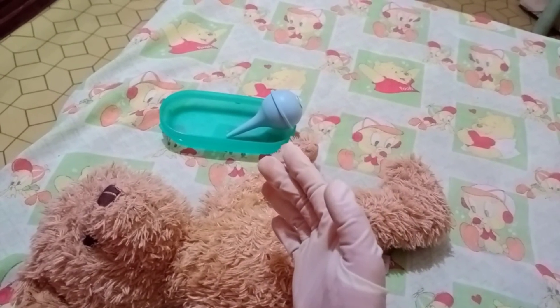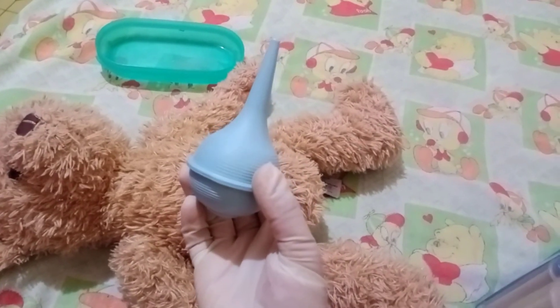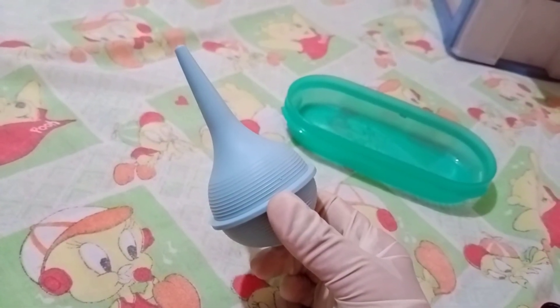Discard the collected secretions properly and clean the receptacles. Wash the bulb syringe in warm soapy water, rinse and dry. Place the bulb syringe back in the newborn's bassinet for future use. After all the procedures, remove our gloves and do hand hygiene.